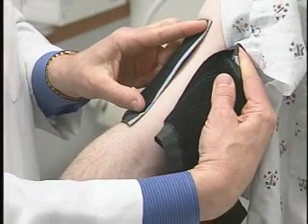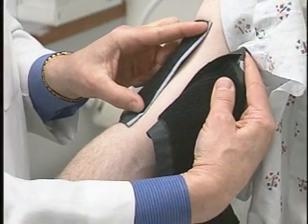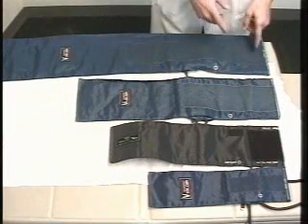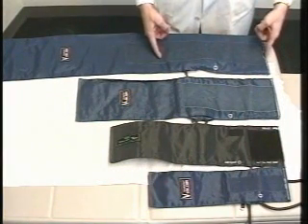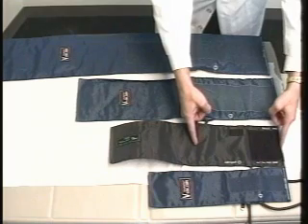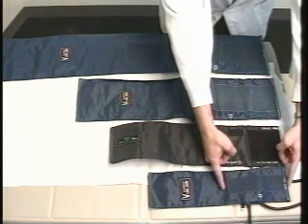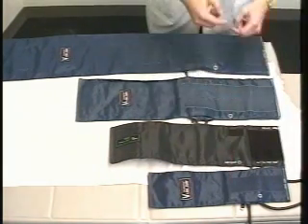When you wrap the blood pressure cuff around the patient's arm, the bladder should be at least 80% of the circumference of the arm. The length of the bladder does not represent the entire length of the blood pressure cuff. Notice where the tubes come out of the blood pressure cuff, and notice that that area is thicker. This is where the bladder of the blood pressure cuff is, and it's the length of the bladder that we're interested in, that should be 80% of the circumference of the arm to be the correct size.